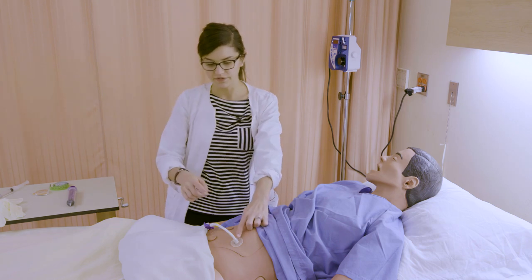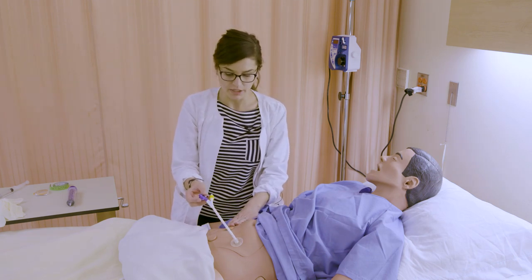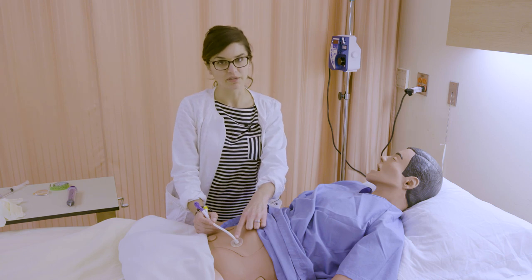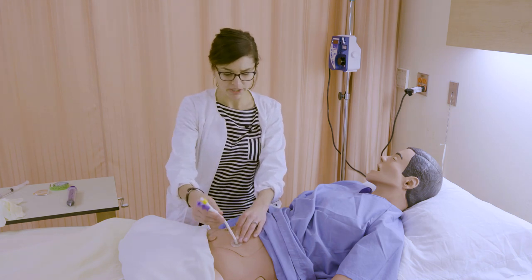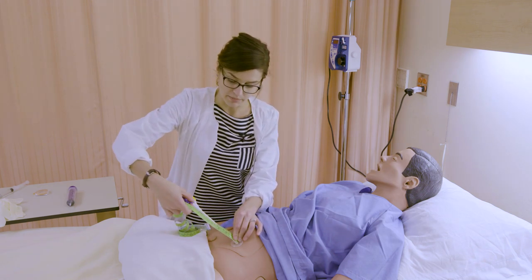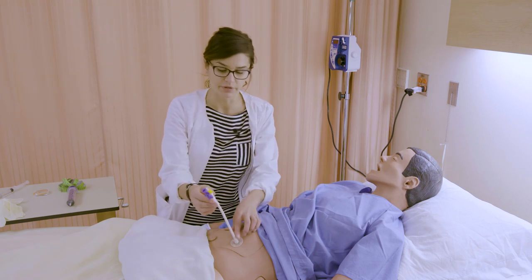When caring for this tube, one of the things you want to note is the external length of the tube. They have helpful markers on them, though the markers may rub off over time since the tube can be in place for up to six months. You may need to measure using a measuring tape — typically from the bolster up to the top of the purple feeding port. For example, this one is measured at nine inches, and you'd want to verify that with information in the chart if the markings aren't helpful or accurate.